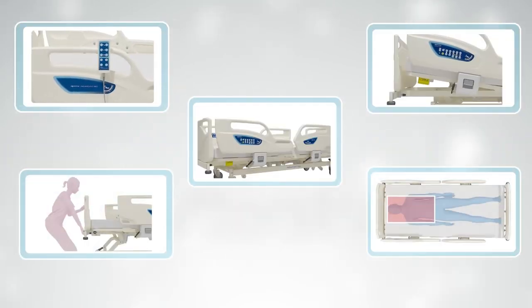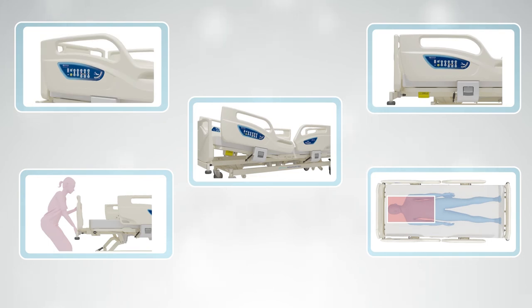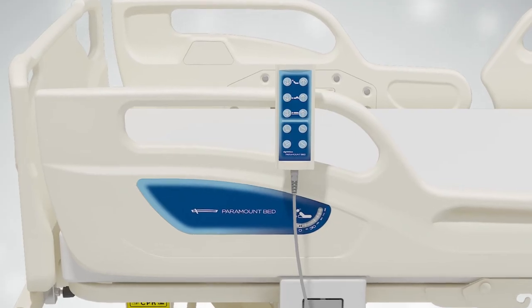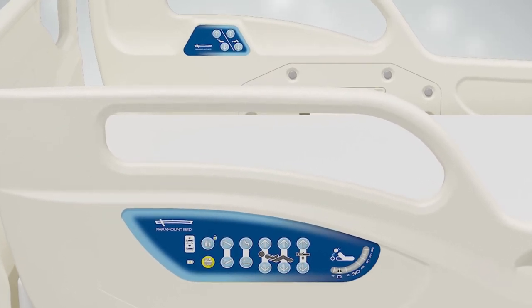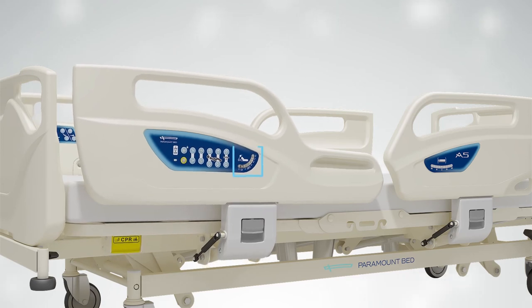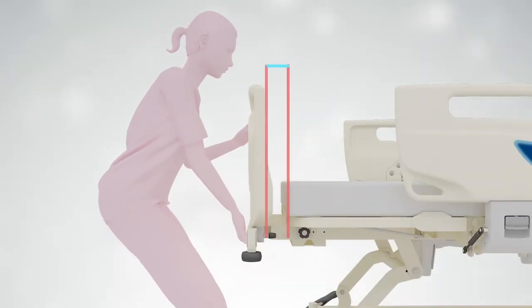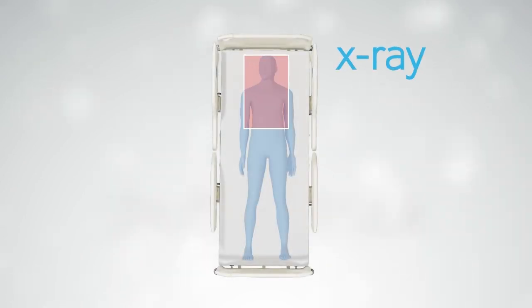The Paramount Bed A5 series comes equipped with a variety of additional features, all designed to aid the patient in a safe and speedy recovery: a side rail integrated panel with additional hand-held controller, both an electronic CPR button and manually operated CPR lever, an angle indicator that measures the patient's position, an easily operated extendable frame, and the bed is made of x-ray compatible materials.